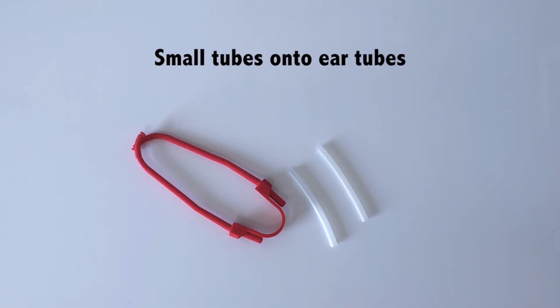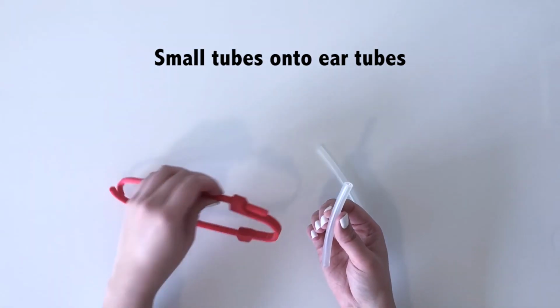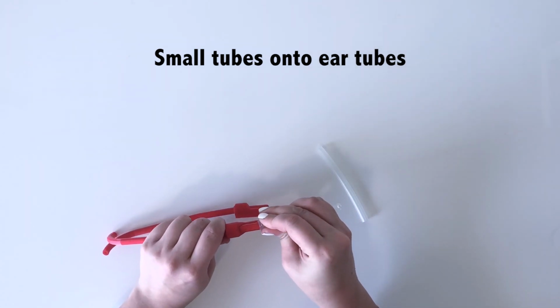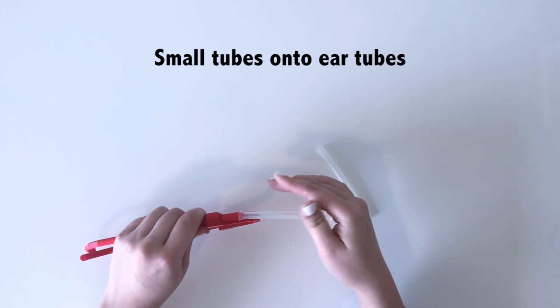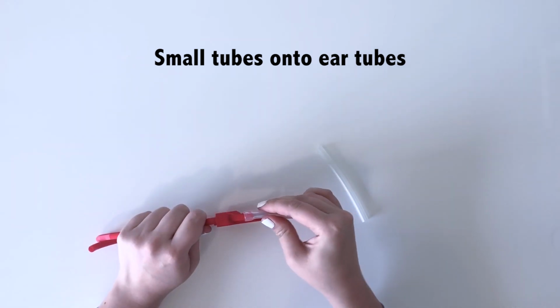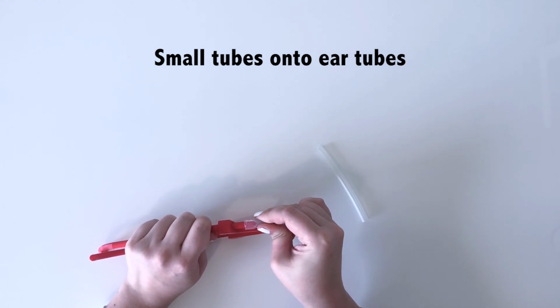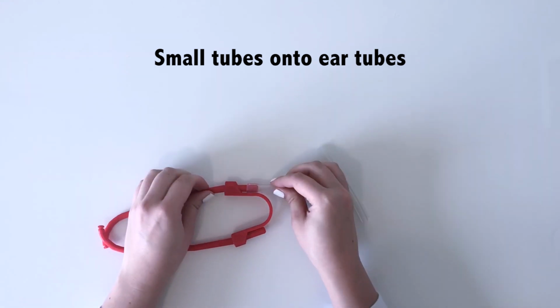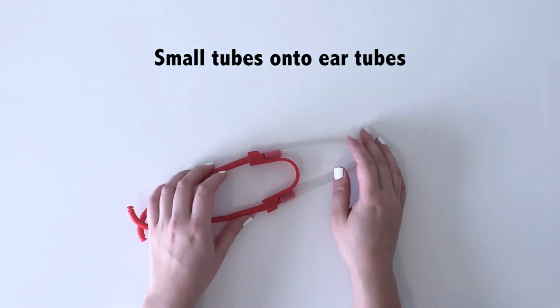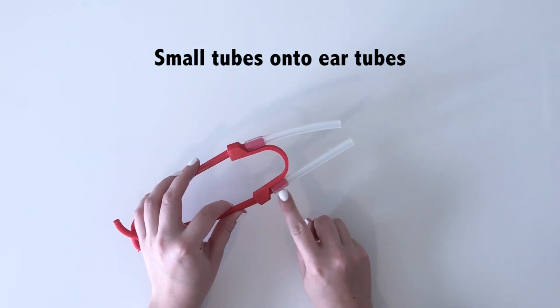Next, push the small tubes onto the bottom of the ear tubes. There can be some resistance, so you may need to apply more pressure. This is the most time-consuming step of the process. When you're done, the tube should be approximately 2 centimeters high on the ear tubes.